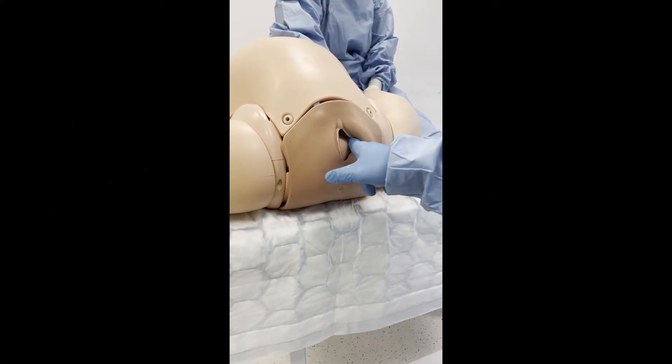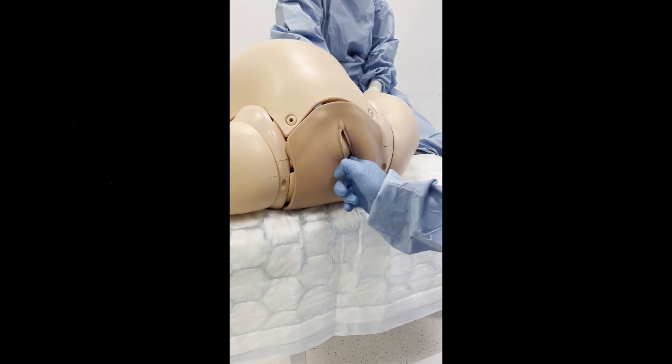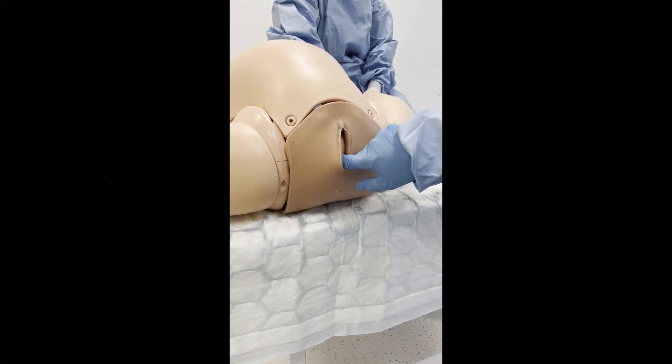The anterior fontanelle is at the three o'clock position and the posterior fontanelle at nine o'clock. This is a right occipitotransverse position, or ROT.